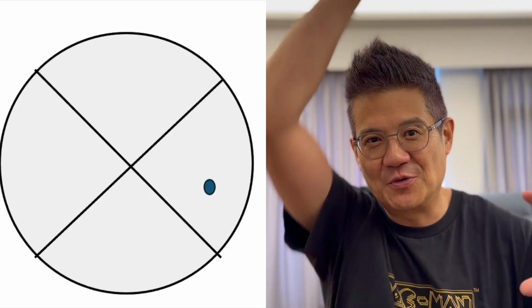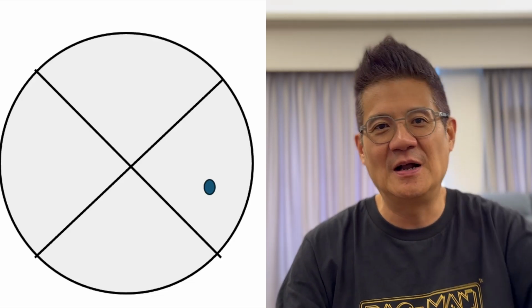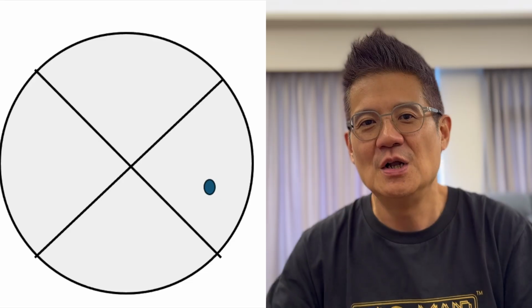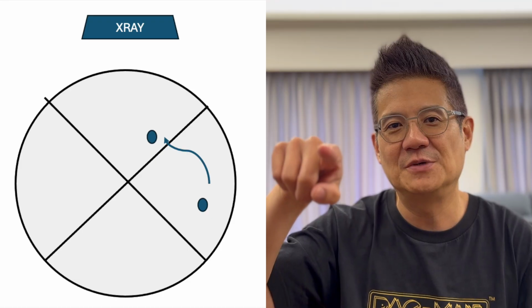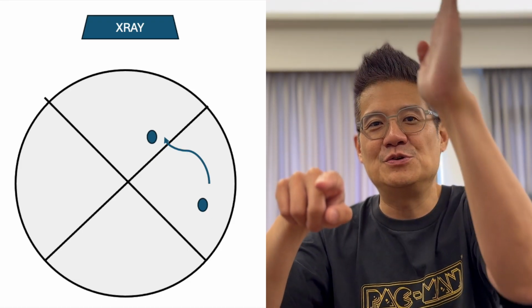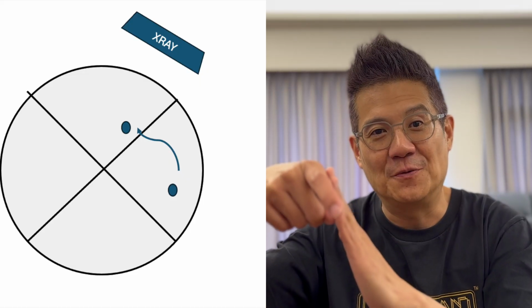And how do you do that? You do that by minimizing the angle you use for your secondary view. Okay, walk with me here. This is your X shape, okay? Quadrants, your X-ray is coming from top to bottom, okay? Let's say you're outside and you can't get an overlap view through your 90 degrees. You rewire the wire and it comes in slightly near this line of the X at the top, okay? And now you look at it and you go quite near to the end of your LAO, let's say, and you can get an overlap view, okay?